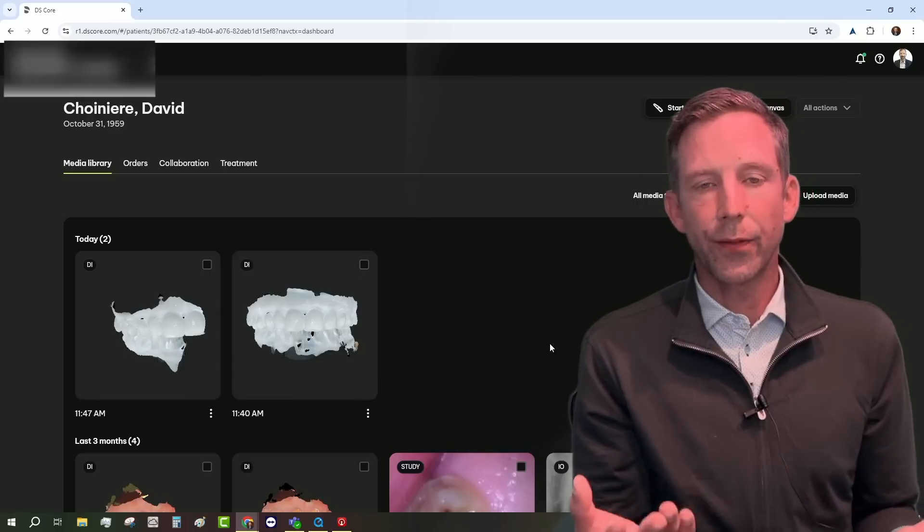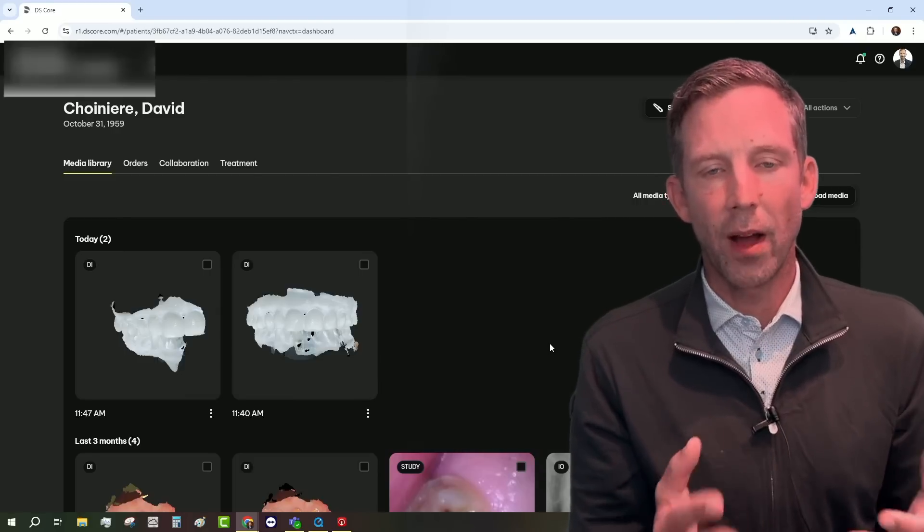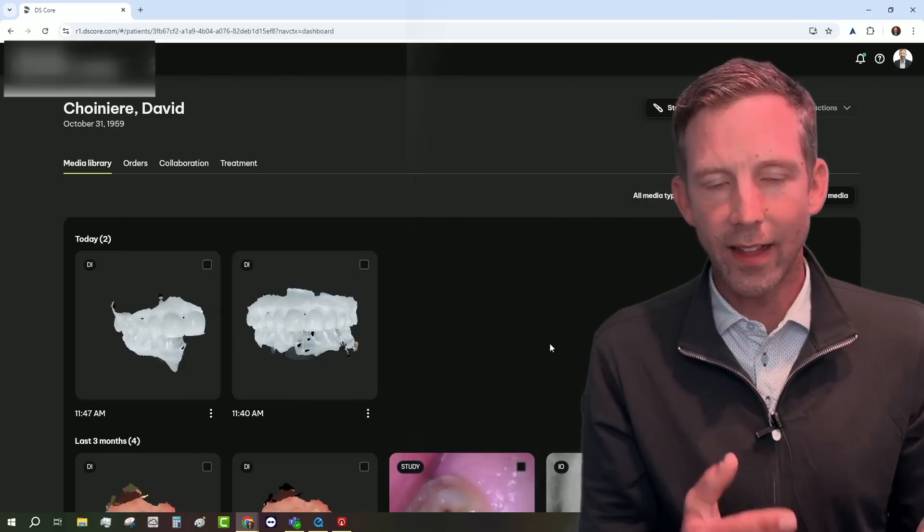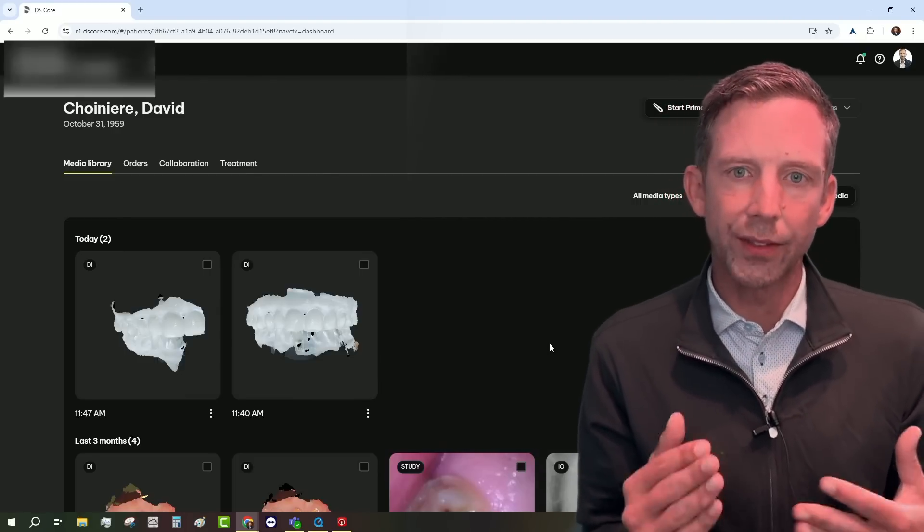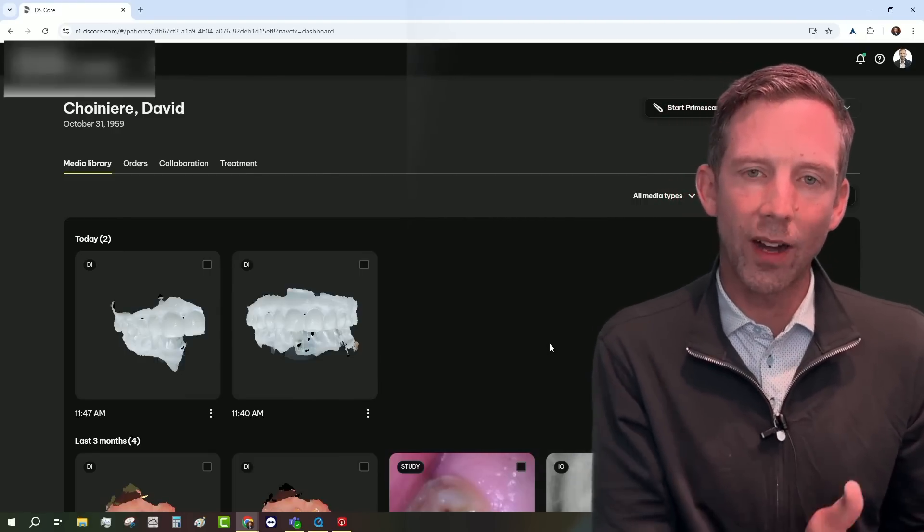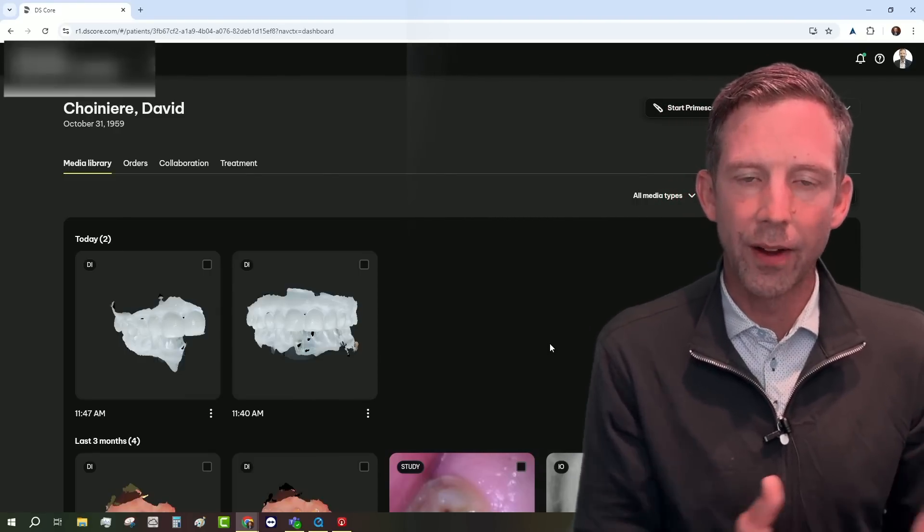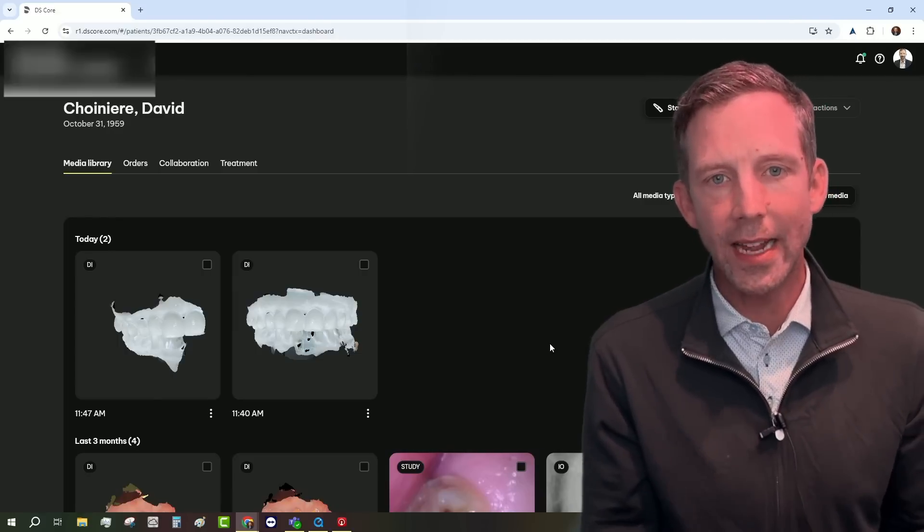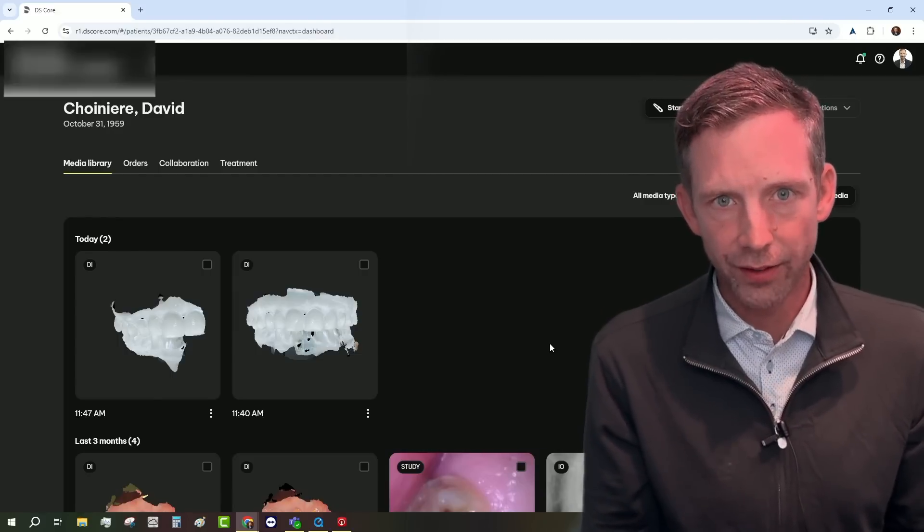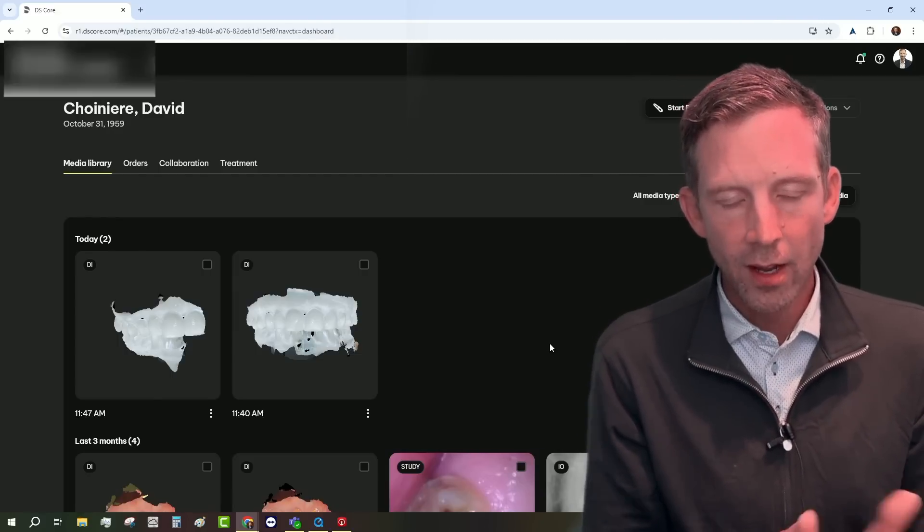So lots of different options, but the main thing that I wanted to show you is the beauty of scanning directly to cloud. The cloud-based scanner, scan anywhere where you want to go.